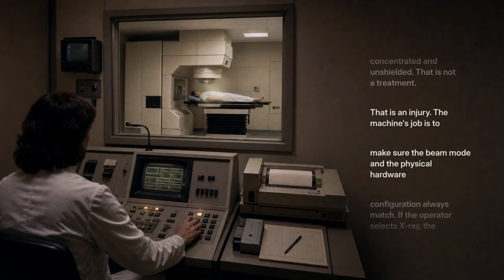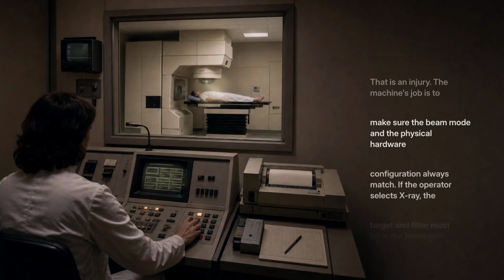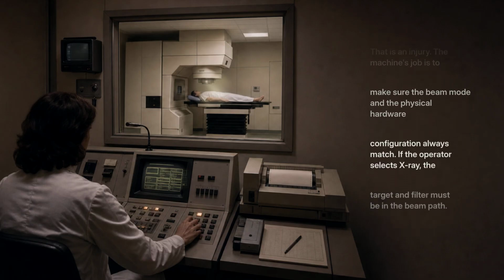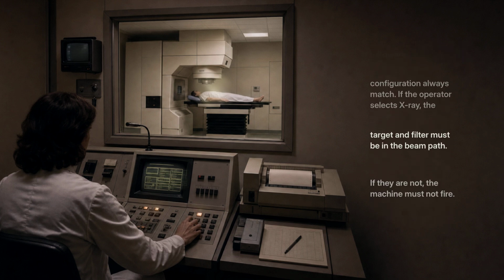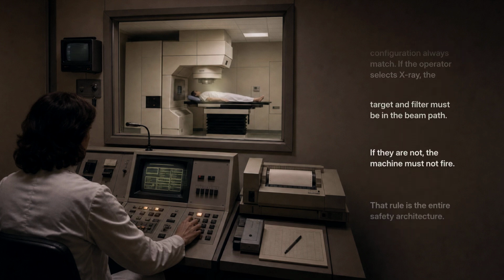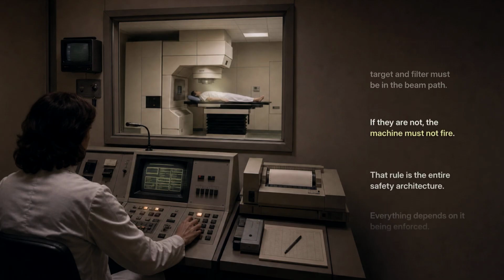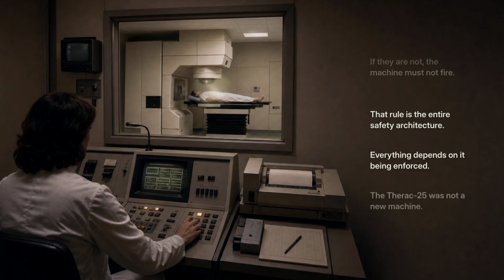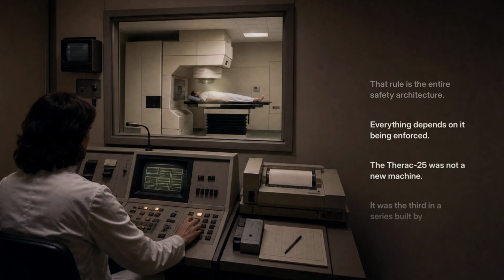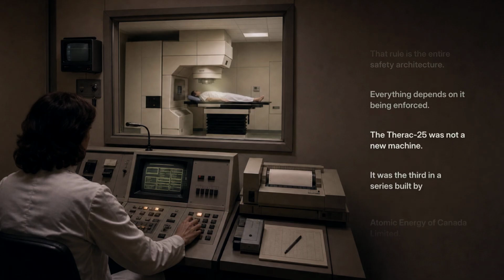That is an injury. The machine's job is to make sure the beam mode and the physical hardware configuration always match. If the operator selects X-ray, the target and filter must be in the beam path. If they are not, the machine must not fire. That rule is the entire safety architecture. Everything depends on it being enforced.